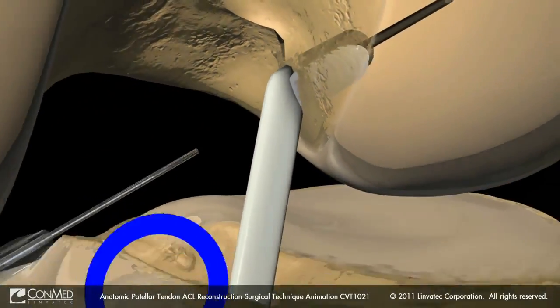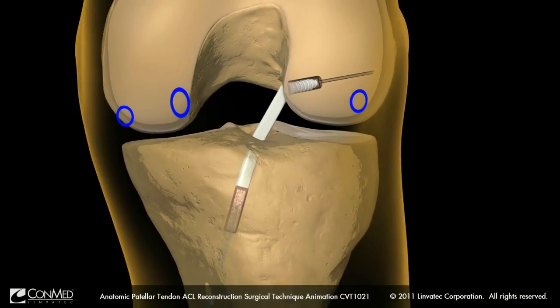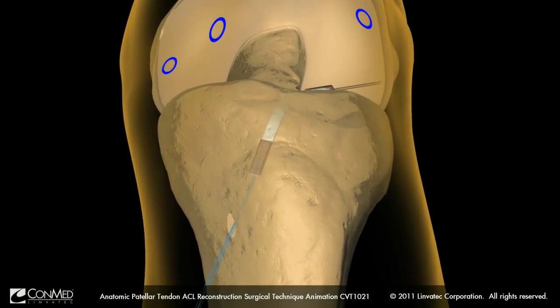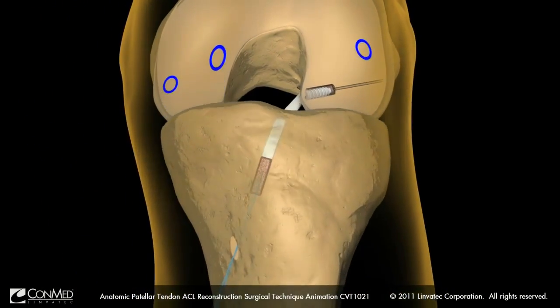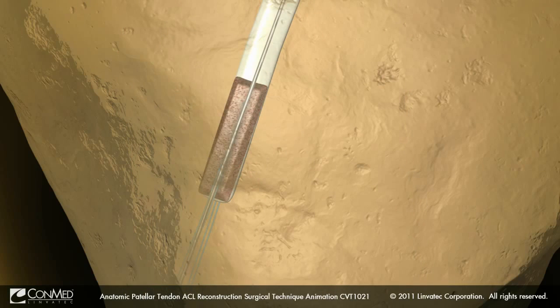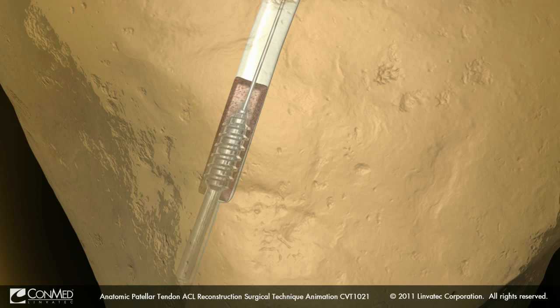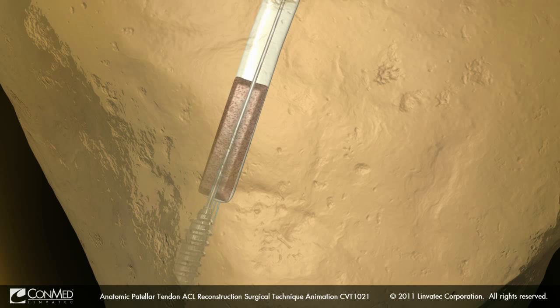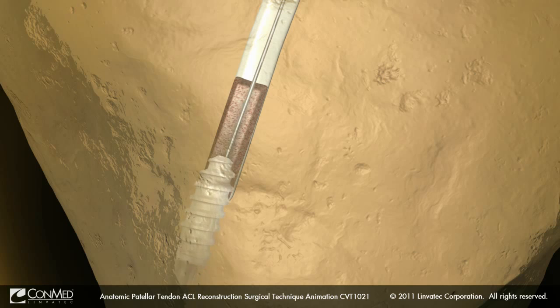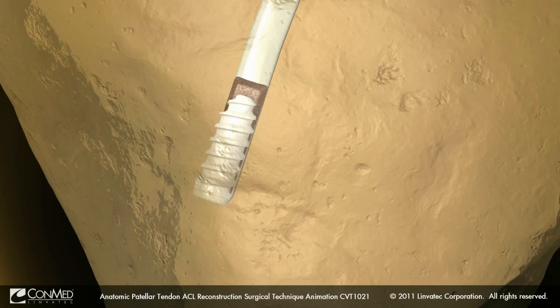Once the graft is positioned appropriately in the tibial tunnel, cycle the knee with distal tension on the graft to remove laxity. Insert the guide wire. With the knee in 15 degrees of flexion, keep tension on the graft and apply posterior drawer force to the knee. Advance the tap, rotating clockwise until the appropriate depth marking, to create threads in the tibial tunnel and BTB graft. Remove the tap, leaving the guide wire in place, then insert the Genesis matrix interference screw anterior to the graft.